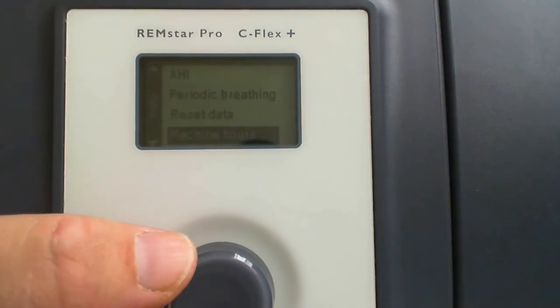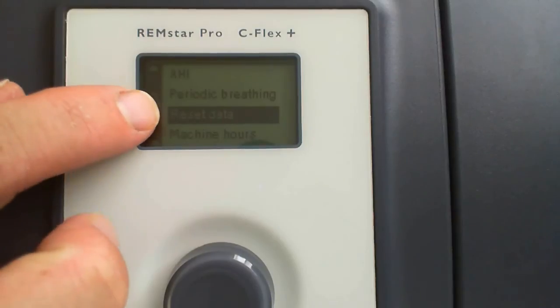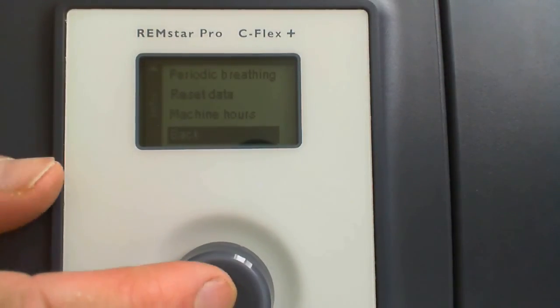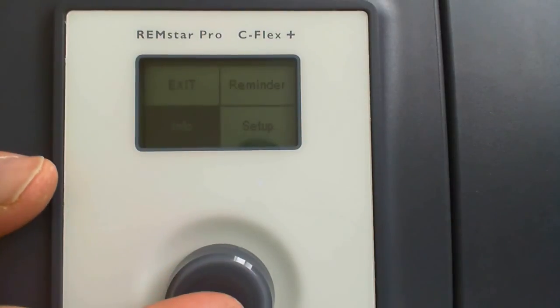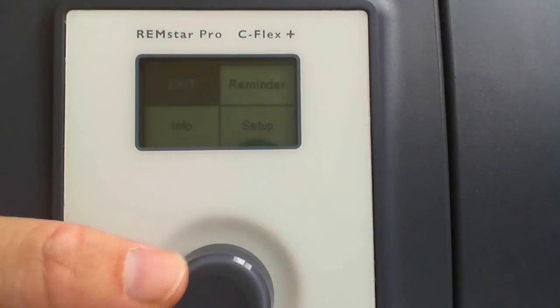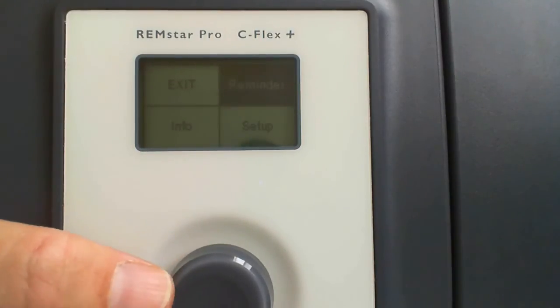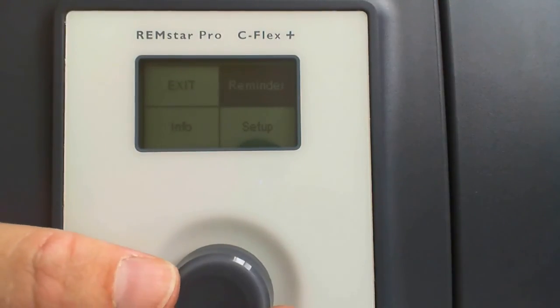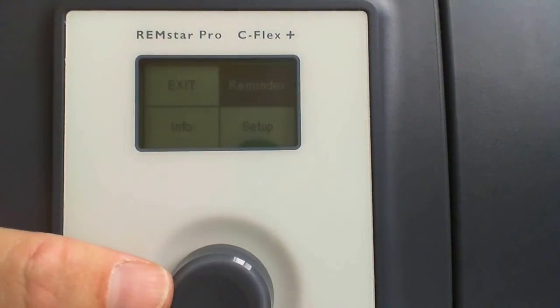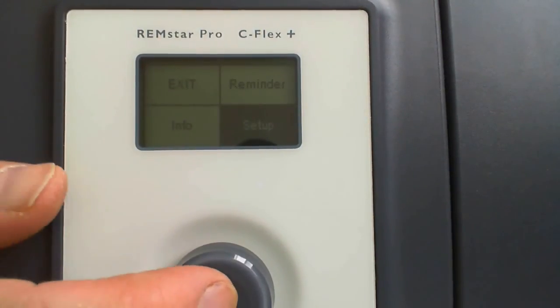The only thing that's different in here is really this reset data. I think that resets your 7-day counter. I don't think it'll do the 30. I've seen some DMEs having trouble with that when they brought out an auto PAP machine for us to try. They were able to set the 7 days, but they weren't able to set the 30, or they were able to set both of them and not the overall blower hours and that kind of stuff.